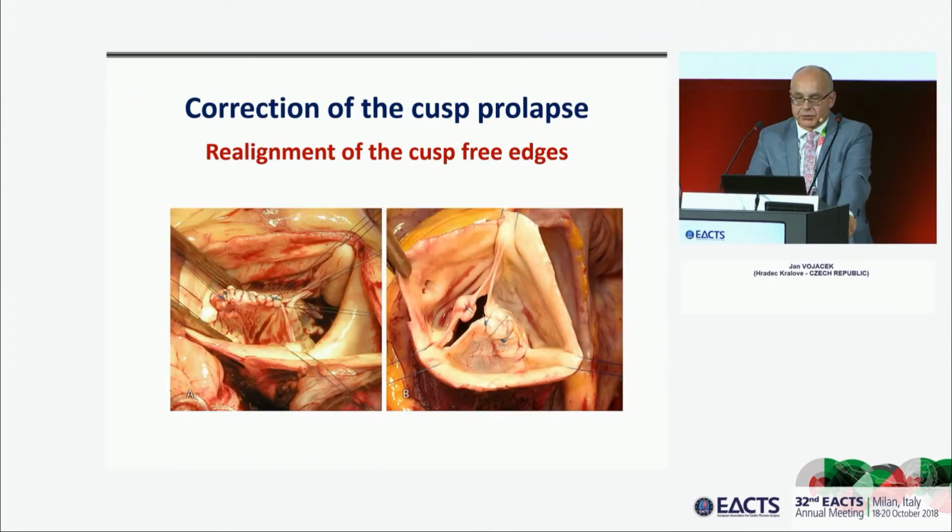Again, this is another example from the surgery. This is a rare phenotype of bicuspid aortic valve with the fusion of the right and non-coronary cusps. And you can see this is the left coronary cusp, and there are actually two separate ostia of the LAD and circumflex. And this is another example of bicuspid aortic valve where we have to resect a heavily calcified raphe.